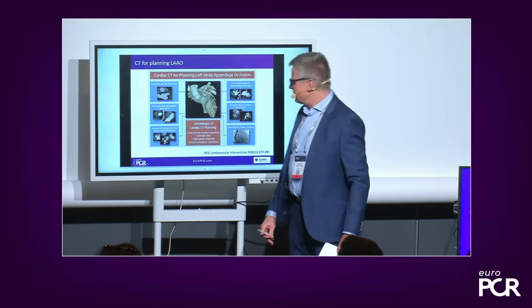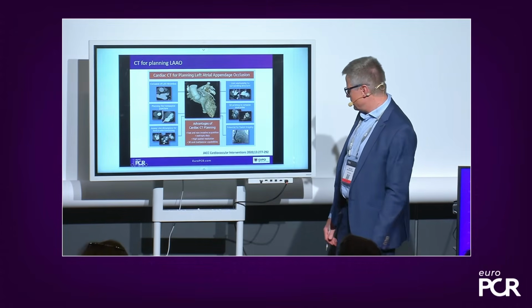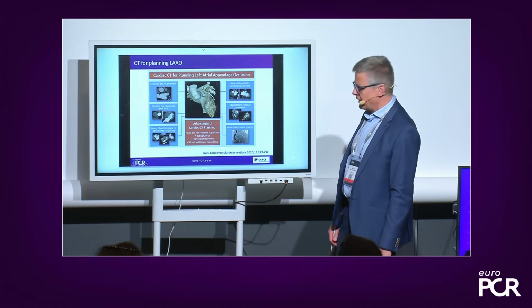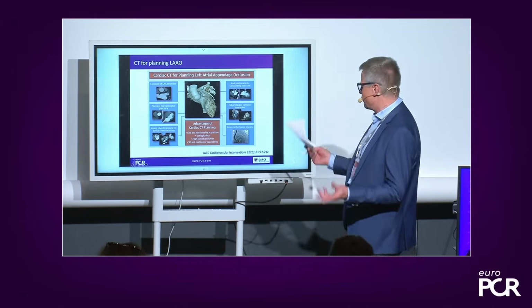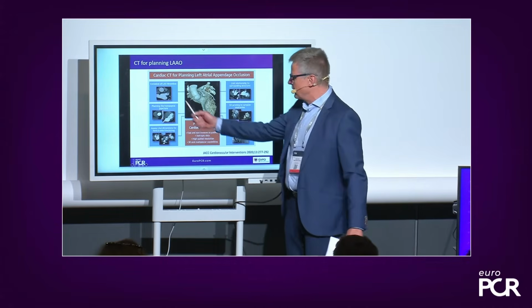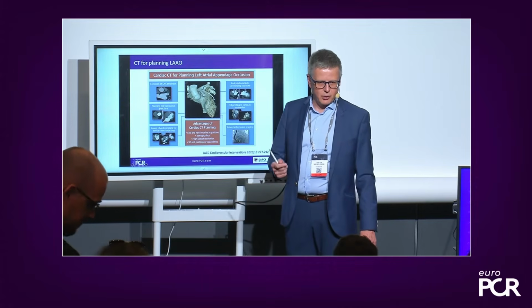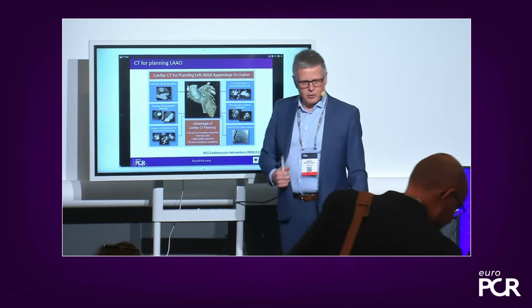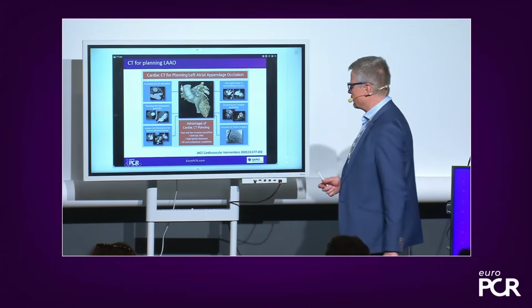Yeah. Great questions, Darren. I've put up a slide here on the smart screen because that is from a consensus paper we did 2 years ago. So if you are not familiar with pre-planning by cardiac CT, you can see what is the optimal protocol and what can you get from this. This is a good technology to rule out thrombus, as we already have alluded to. Use always a delayed scan so you can discriminate slow flow from thrombus.